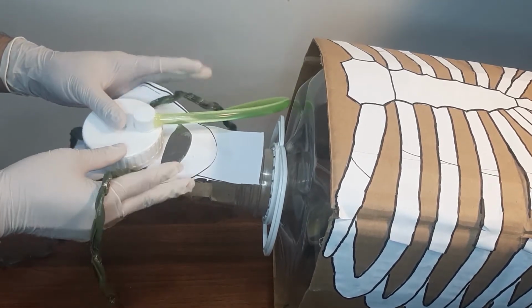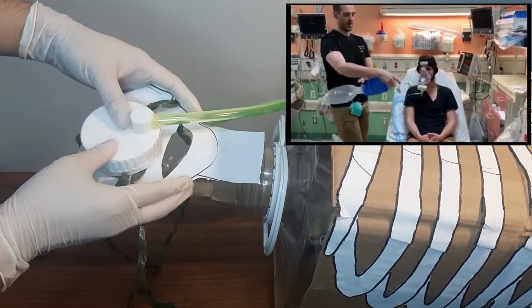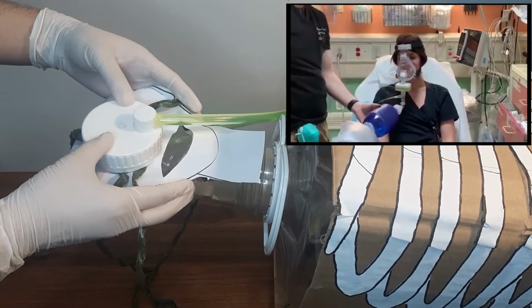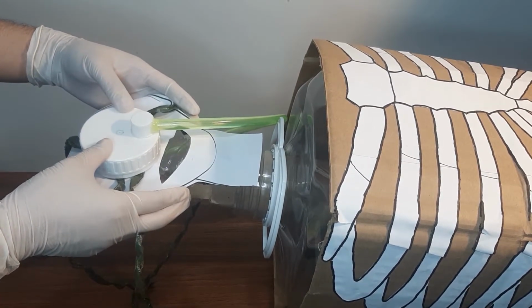Pre-oxygenate the patient with 100% oxygen for 5 minutes with continuous positive airway pressure or CPAP with a PEEP of 10 cm H2O or with non-invasive ventilation. There should be chest expansions present and no leakage through the sealed mask.